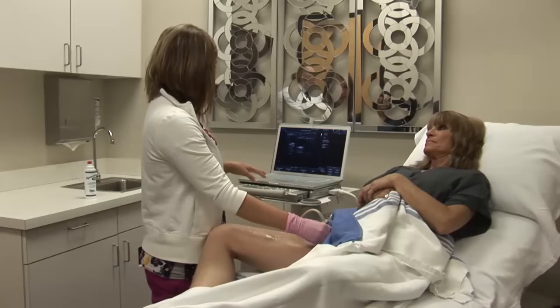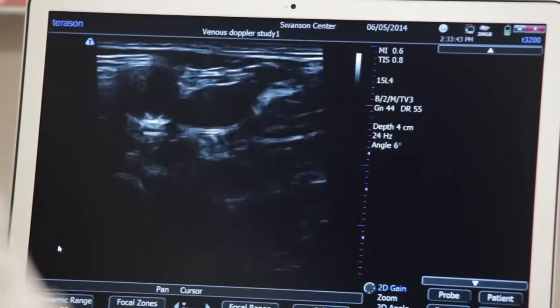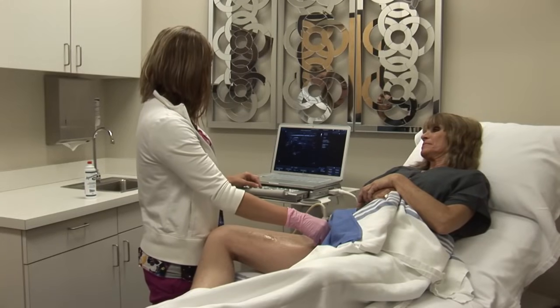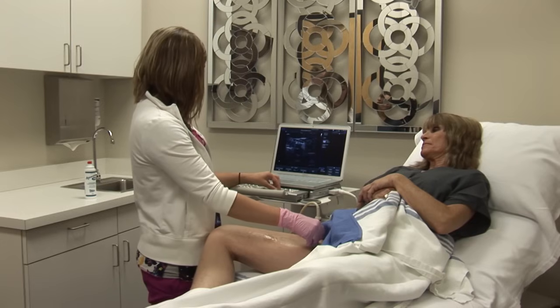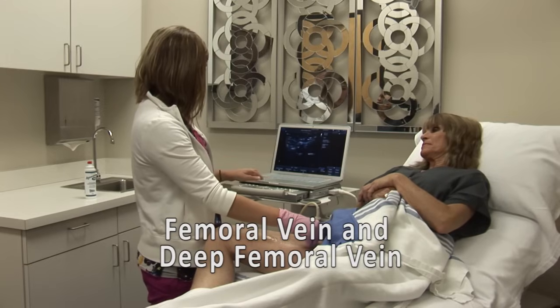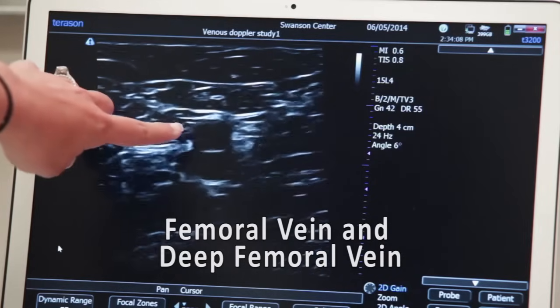As we go distally, we will see the greater saphenous junction coming off the common femoral vein — I'm going to show that compressing. And then we keep going distally on the thigh, and we're at the bifurcation of the superficial femoral and the deep femoral vein. We'll show both of them compressing here. They are deep to the artery.